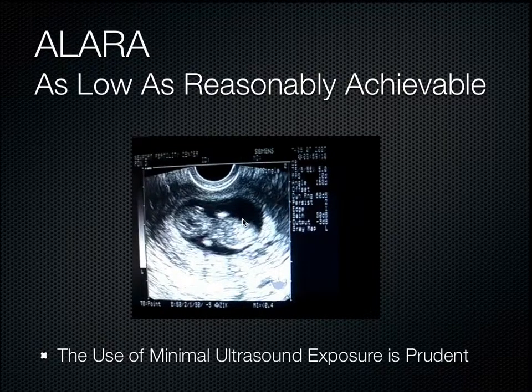And we tried not to use ultrasound on him that much when he was a fetus. But if you look at the world's literature on the bioeffects of ultrasound, there certainly are bioeffects. There's something called the mechanical index and the thermal index, where we know that there is energy going into the tissue, into the patient. And so we want to be aware of that and remember the ALARA principle and not use unnecessary ultrasound when we don't need to. So that's something just to be aware of, though.